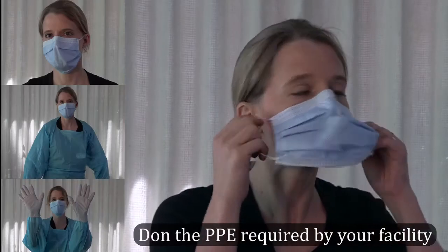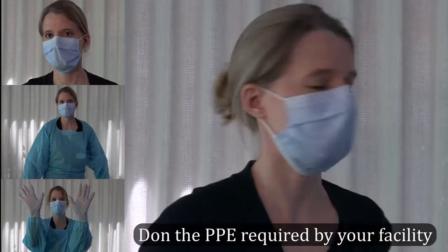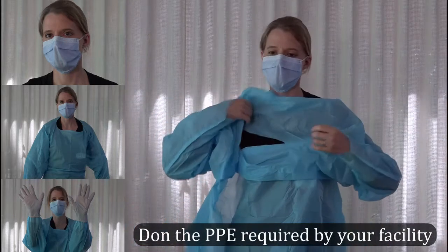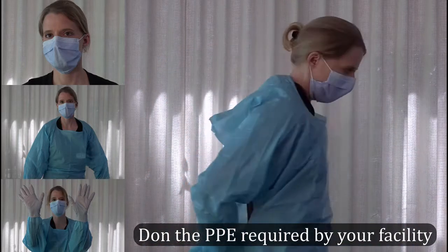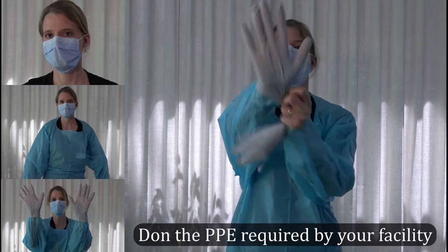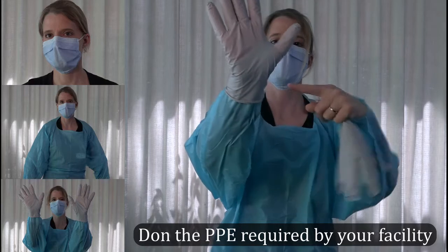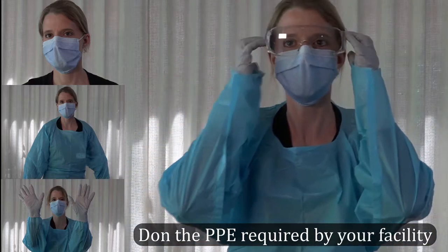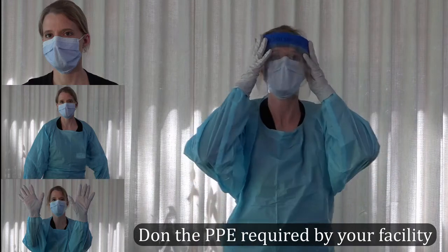Place a medical mask on the face so that it covers the mouth, nose, and chin and is secure to the face. Apply a medical gown if necessary. Then place gloves on hands, ensuring that they cover the wrists and are placed on top of medical gown sleeves if applicable. Place safety glasses or a face shield on to protect the eyes and ensure they are snugly secured.